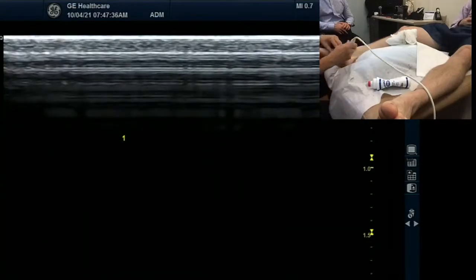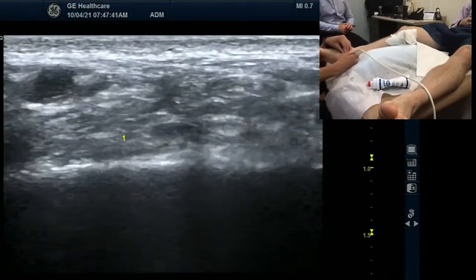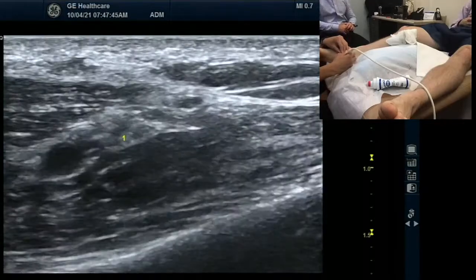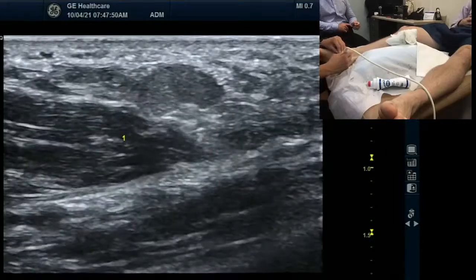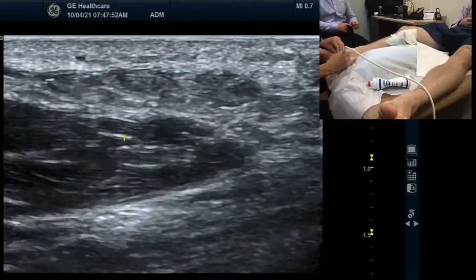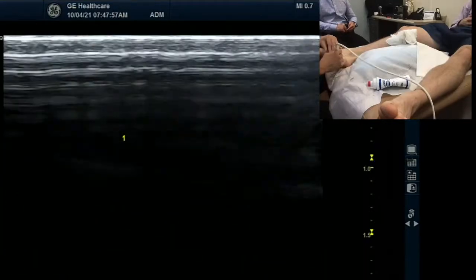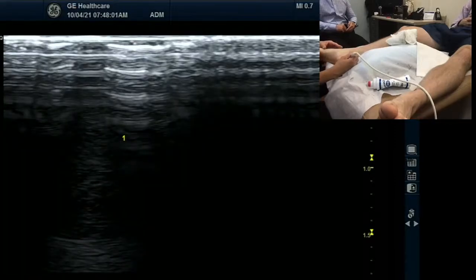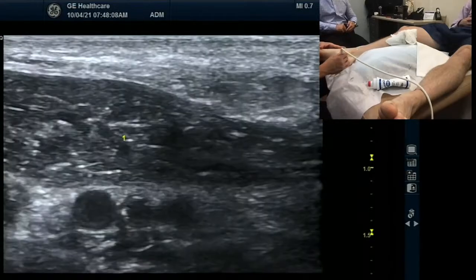Patrick, do you know where it's splitting to? Do you see it? The tibial nerve is splitting in two. Do you see that from the screen? It is hard, right? Right there — split it. The one where the one is, is the lateral one. His one is really clear — it's really nice. Put lateral plantar nerve in the one. Where the one is — that's the lateral plantar nerve. Let's try to trace that. It goes in here really deep. So what do you do when you have this patient? Release the retinaculum? Must be right. And then they say there's a tumor — a cyst. Tarsal tunnel syndrome.